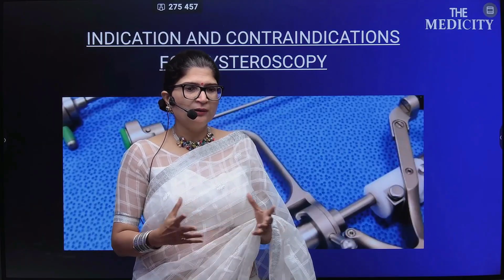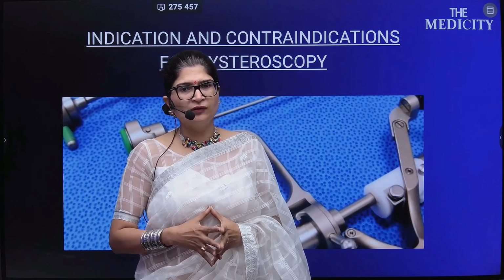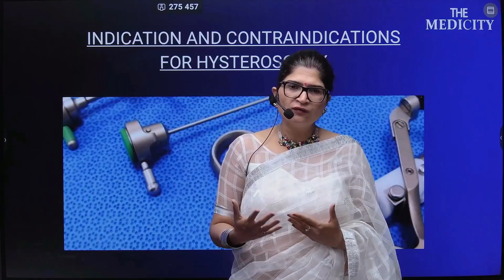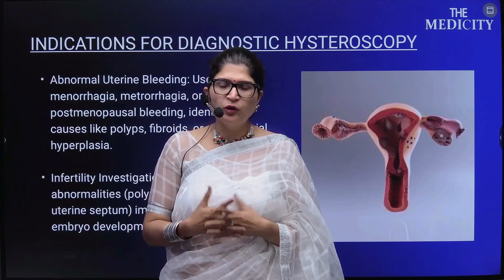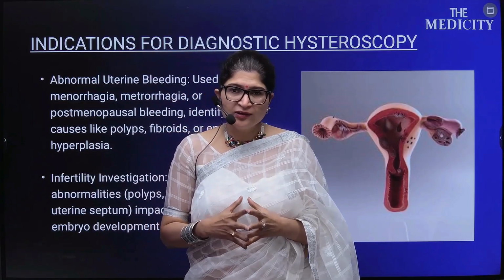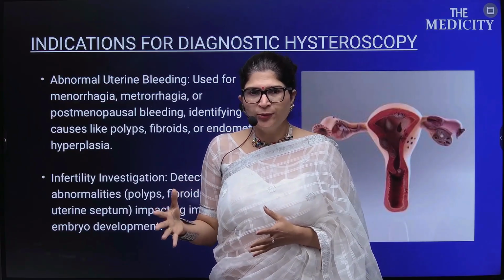The first thing that comes up is the indications. The second thing is what the contraindications are. I'll be talking about a few of the indications where hysteroscopy is used and where we can think of hysteroscopy for a particular patient, and I'll also talk about the contraindications. If I say indications for diagnostic hysteroscopy, what comes to our mind? The clinical condition of the patient is to be assessed, and then hysteroscopy can be thought of as a rescue procedure, as an investigation, or as a therapeutic procedure.